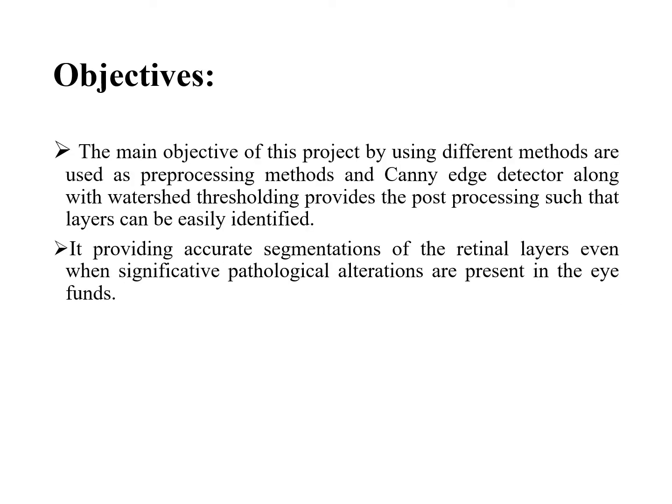Coming to objectives, the main objective of this project is that different methods are used as pre-processing methods, and the canny edge detector along with watershed thresholding provides the post-processing such that layers can be easily identified. It provides accurate segmentation of retinal layers.